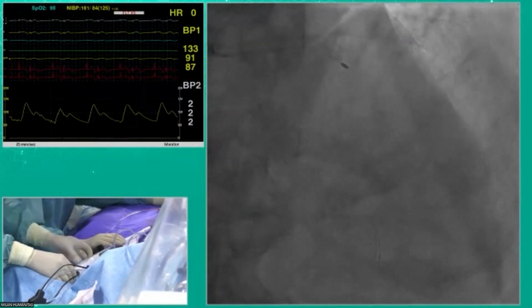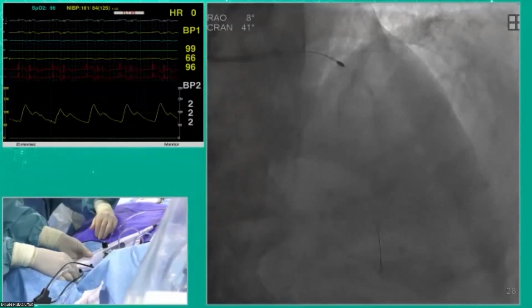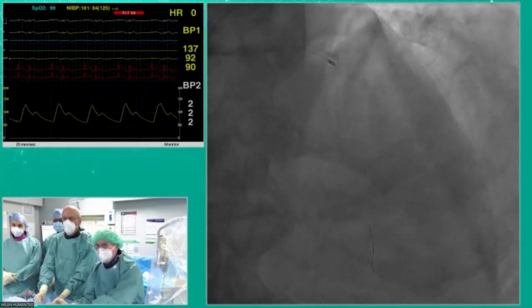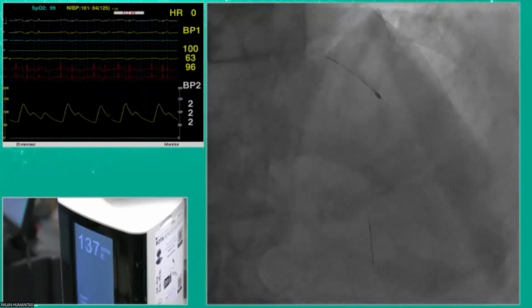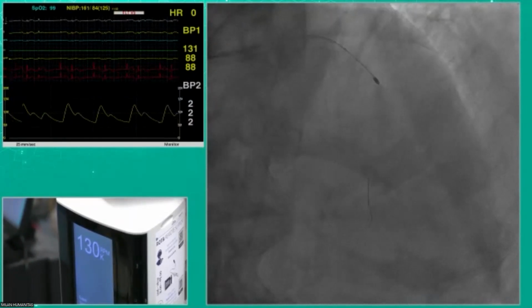You know, I'm not used to this RotaPro. I always look for something on the down. Yeah, I have the same problem, Dr. Colombo. My muscle memory is still bad for the RotaPro. Yeah, I think it's okay. But yeah, and the curve. Do some work here. It will make our life easier afterwards. Advance the wire a little bit.